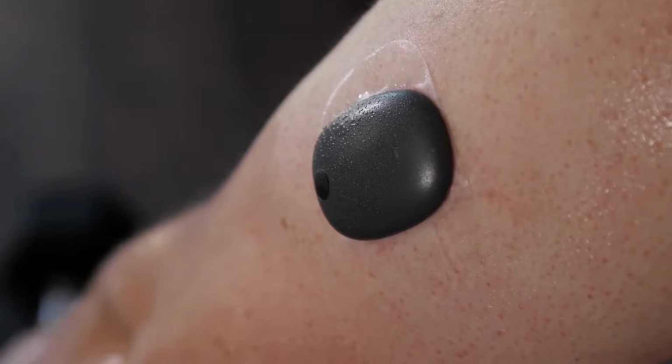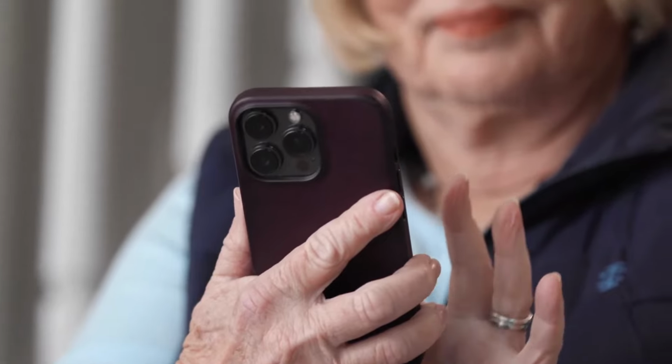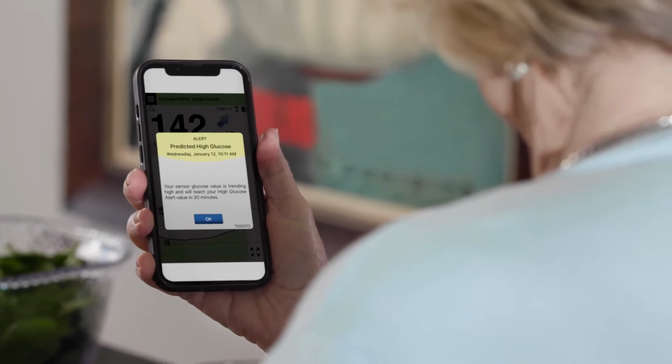So if you're going to get an alarm and alert, even if your phone were turned off, the way Eversense works is you get on-body vibratory motors, right? So there's a very obnoxious, heavy hypoglycemia alarm that you're not going to miss. There's a very strong hyperglycemic alarm, and they're different, so you'll recognize the signals. And that's if you didn't have the phone.